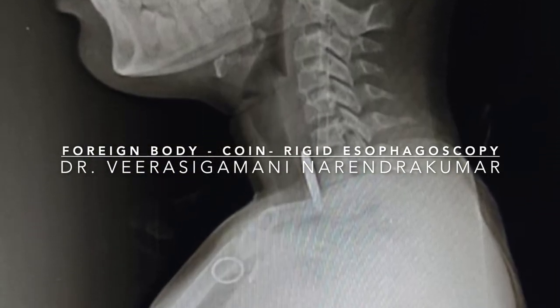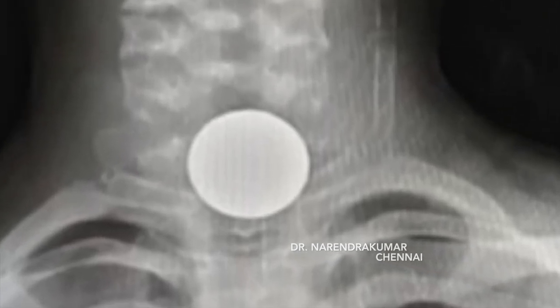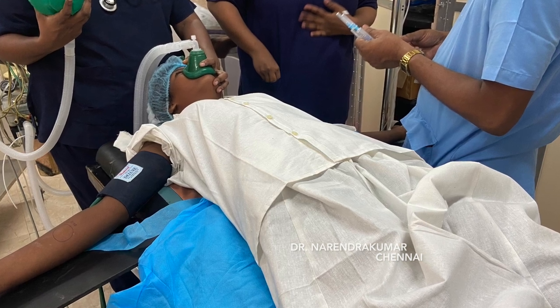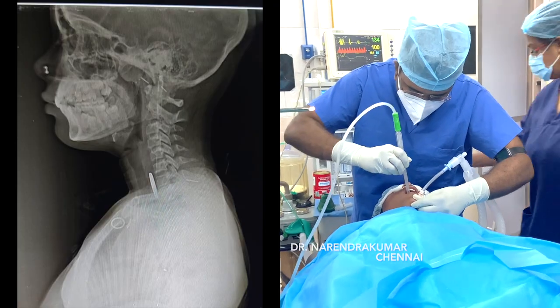This is Dr. Narendra Kumar from Chennai, demonstrating a foreign body coin removal using a rigid esophagoscope. The child is 10 years old and accidentally swallowed a 10-rupee Indian coin. The patient is under general anesthesia.